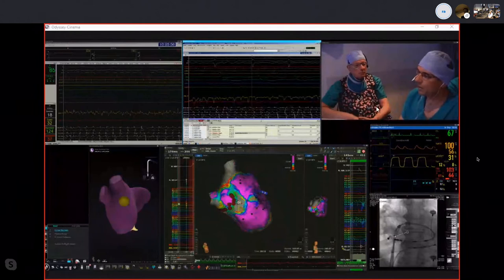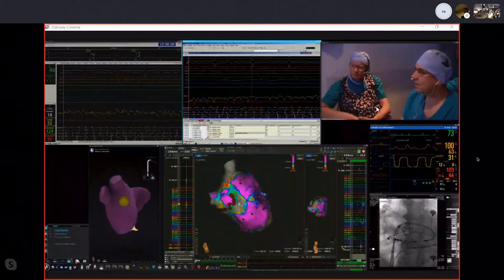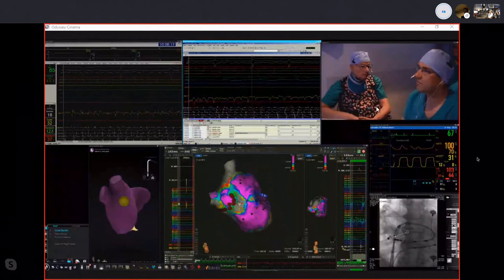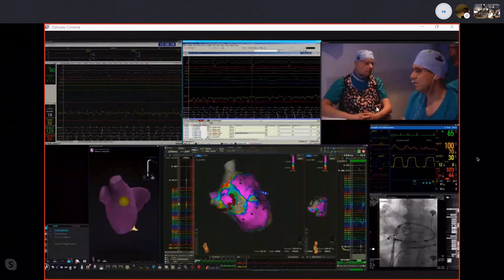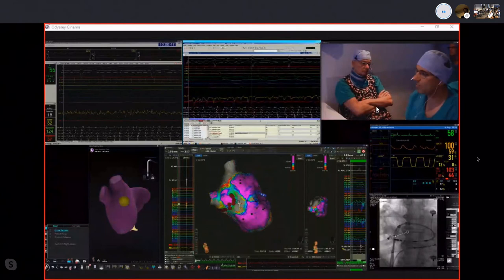Okay, so we have now, let's say, a several year long experience with this robotic sheath. And what we demonstrated is that for PVI, for AF ablation with a target of circumferential pulmonary vein disconnection, when compared to a non-steerable sheath, it actually allowed us, and we published this initial experience in Europace about 5 years ago, we demonstrated that we can obtain the disconnection of the PVs quicker, and we deliver less radio frequency for the right PVs than with the manual sheath. Actually, the control group was a manually controlled steerable sheath, and at the time we were using the Agilis.